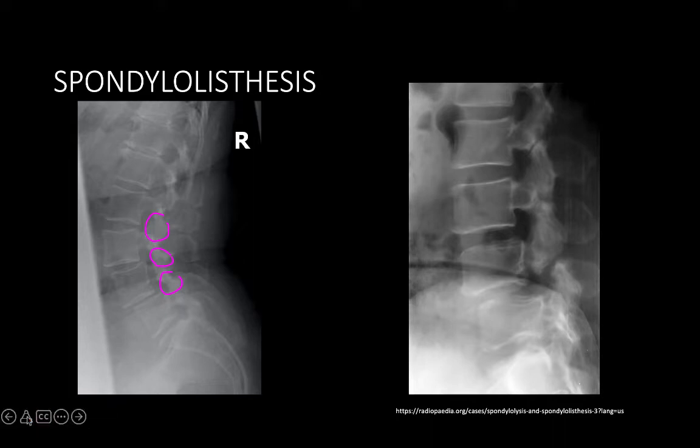Now, really quick before I move on, and I know I'm a little long-winded through these discussions, but I really want you guys to understand this information. Remember, when you name spondylolistheses, you come to the break in George's line first. So all these vertebrae are properly aligned. And now we come to a break in George's line. This break is between 5, 4, 3. So this is between 3 and 4.